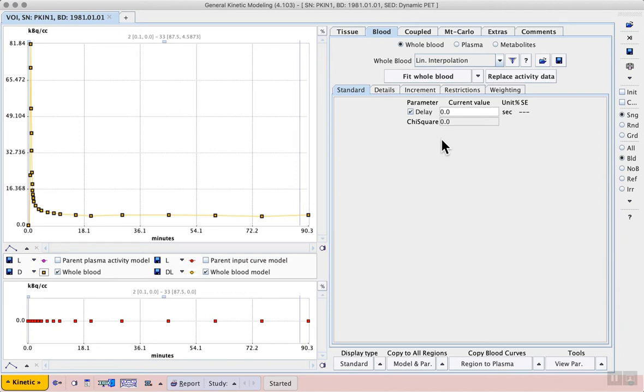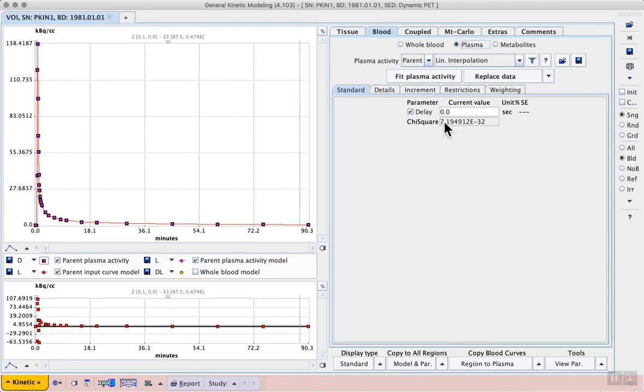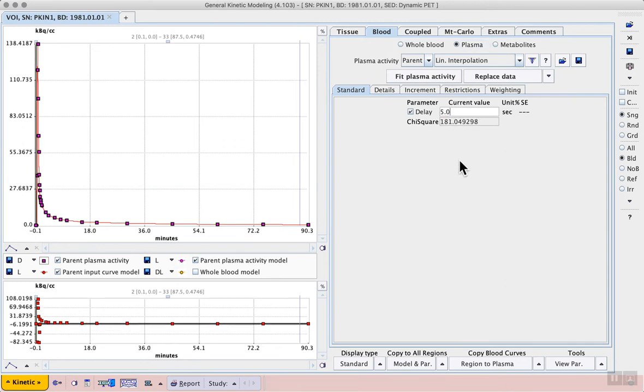We can enter a reasonable starting value for the delay on the whole blood tab and for the plasma. In this case enter a value of 5 seconds for whole blood and for plasma.